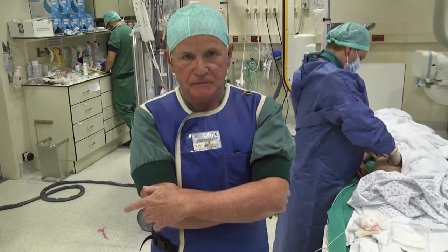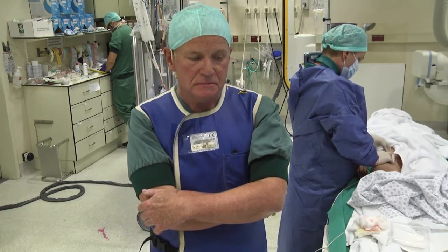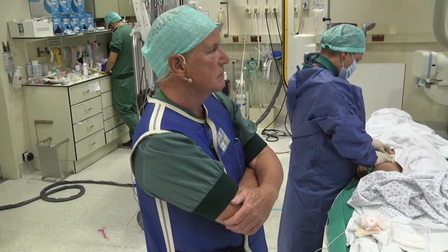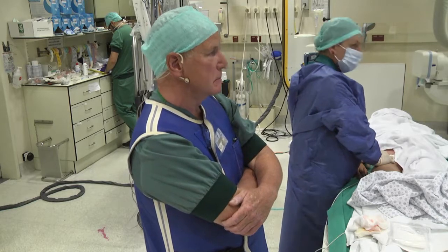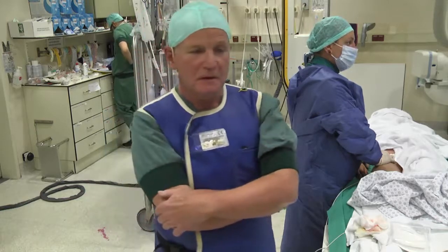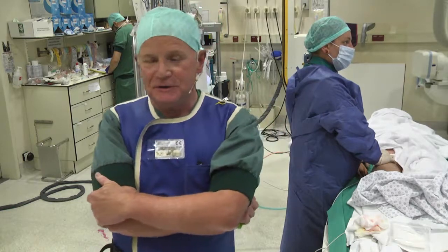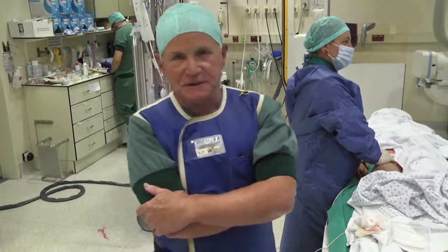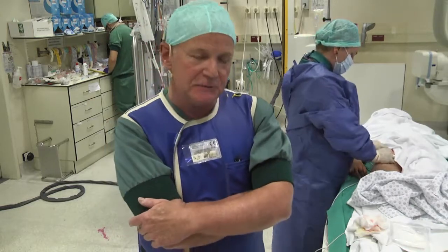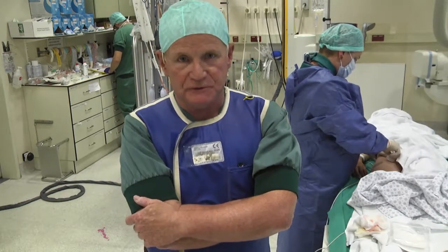Okay. One brief question, go ahead. A short question about the last image. I think we saw some leakage, could well be of the catheter. One thing we must sometimes use is intracardiac echo to check if the valve is perfectly all right, if you're in doubt. Do you have experience using it? Brief answer, Mark. You must be a very rich boy in a rich country. We use intracardiac echo if it's a real indication. In this case, we take all the catheters out and do a transthoracic echo this afternoon, and we will come with the same information.